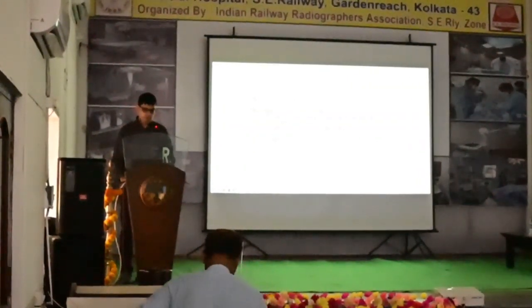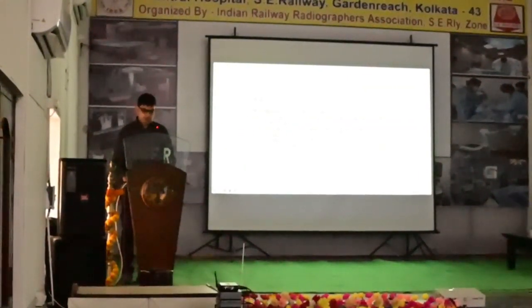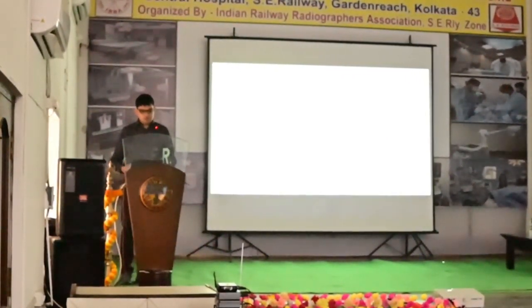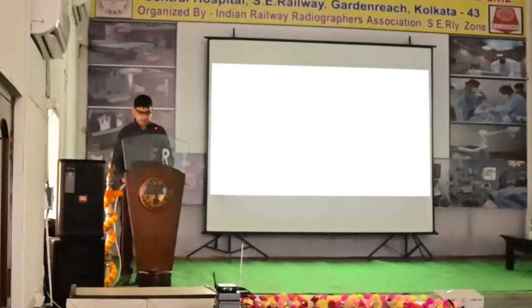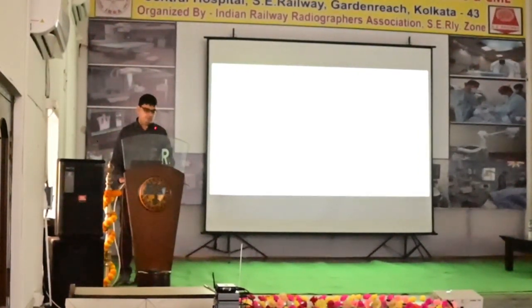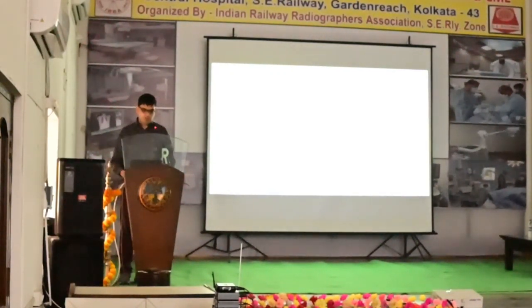600 and the window width is kept at 2000, and we do that using a sharp kernel. If we take images of the pelvis and lower abdomen, they are reconstructed in soft tissue window setting, that is the window level is kept at 40, the window width is kept at 350, and we do it using a smooth kernel.